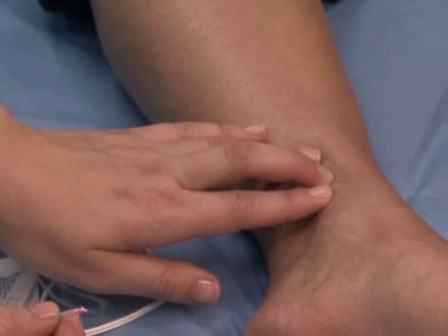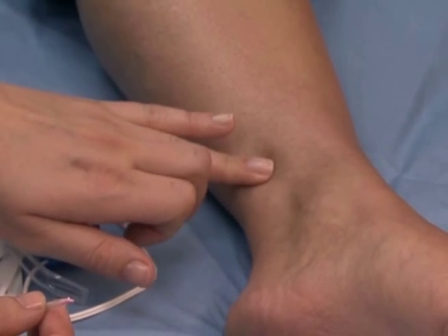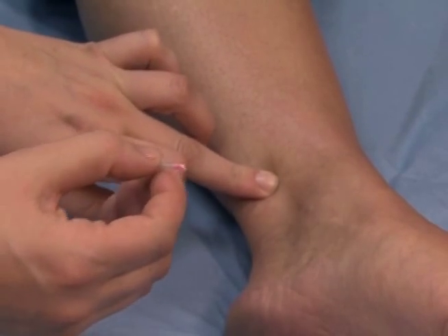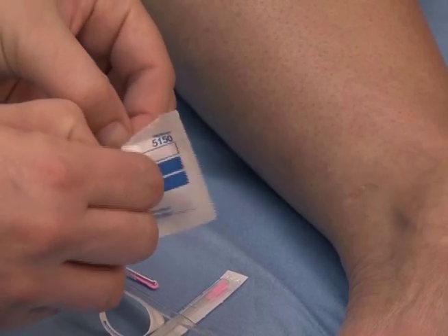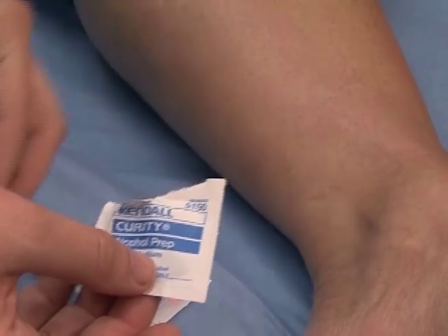The clinician uses their fingers to locate the right place to insert the needle electrode near the ankle — approximately three fingers above the middle of the ankle bone and one finger back from the tibia. The clinician uses a plastic guide tube to mark the insertion spot and then cleans the insertion area with an alcohol pad.